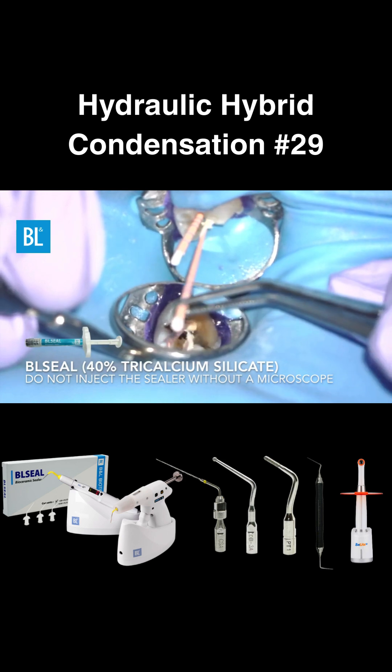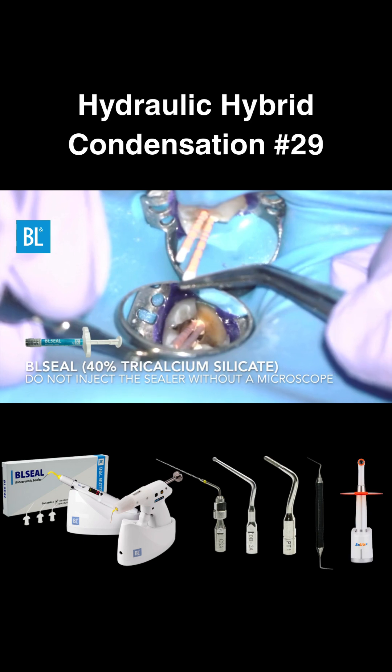I recommend applying BL-seal coating directly to the master cone, unless you're working under a microscope.